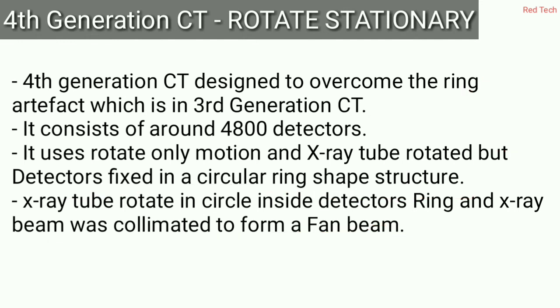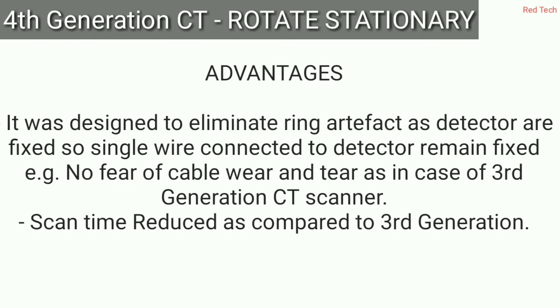So we must remember that the fourth generation was developed to overcome the ring artifact, and in this generation 4800 detectors were used and only the X-ray tube rotated. Now look at the advantages. It was designed to eliminate ring artifact, as I told you earlier.